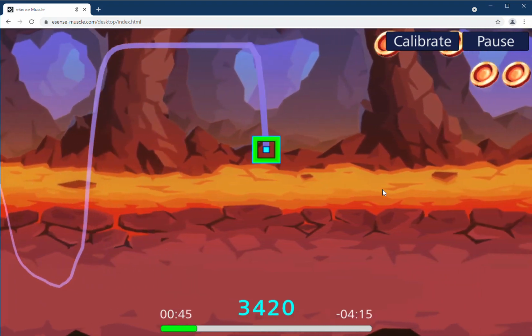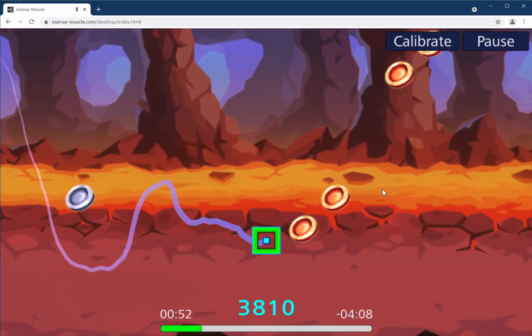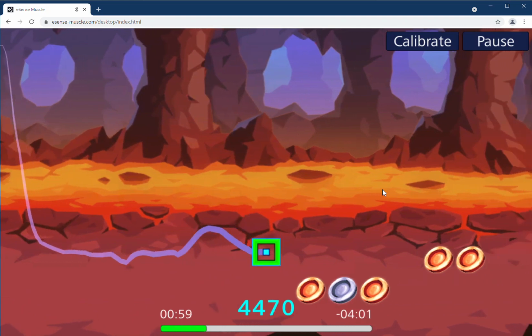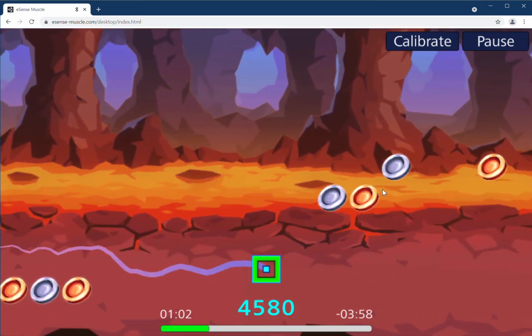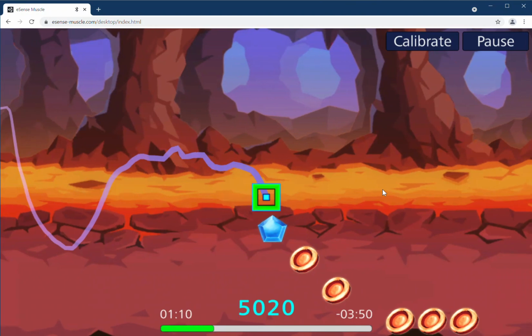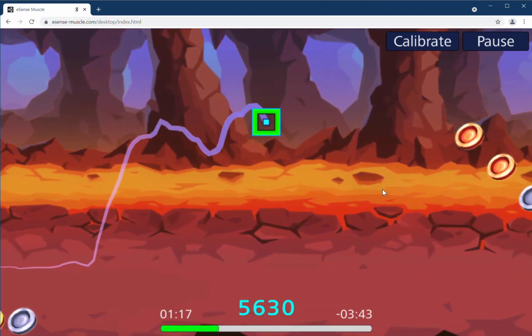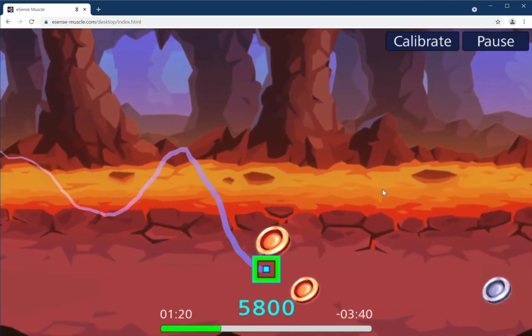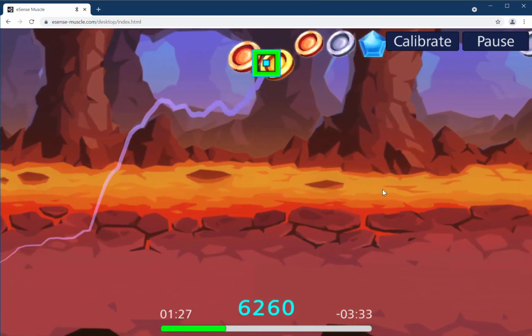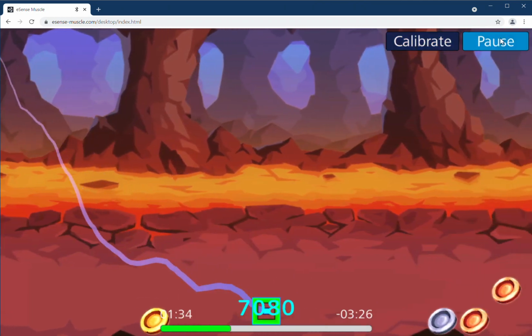And you see that these coins are also arranged in a way that you need to slowly increase muscle tension and then slowly let it down. And I need to really get loose to get to the bottom. And here I have some in the middle, and I try to collect these coins now. Again, contracting. And that's nice and motivating, and getting better scores, not missing any of these coins, and to learn to contract the muscle activity really well. Also here you can recalibrate, you can pause, and you can change the level.